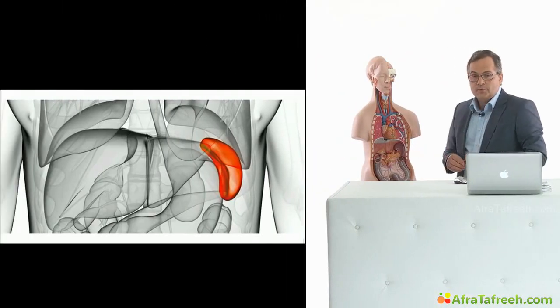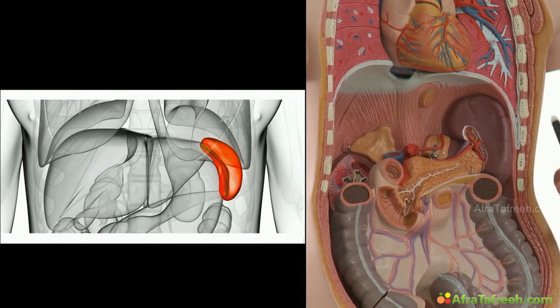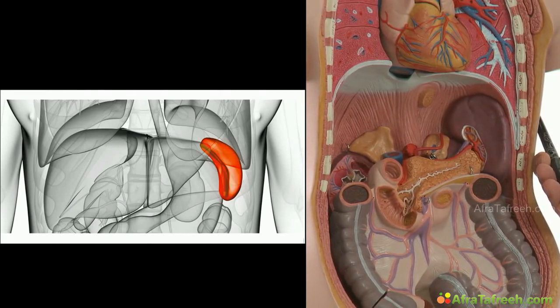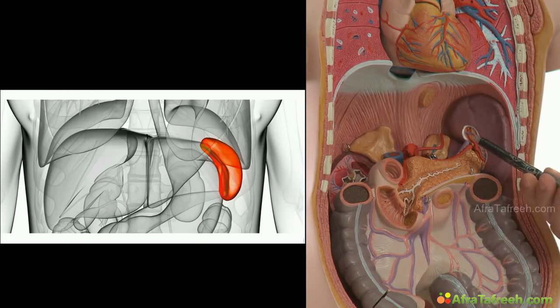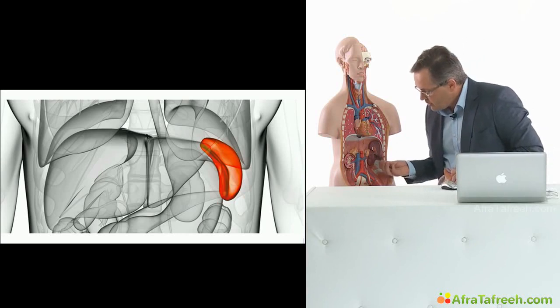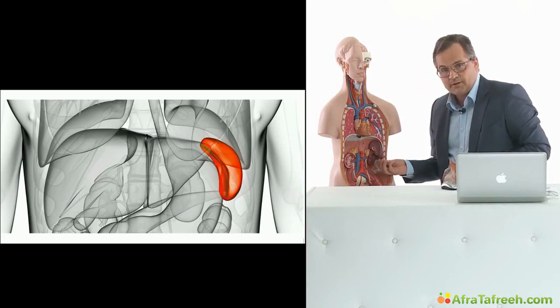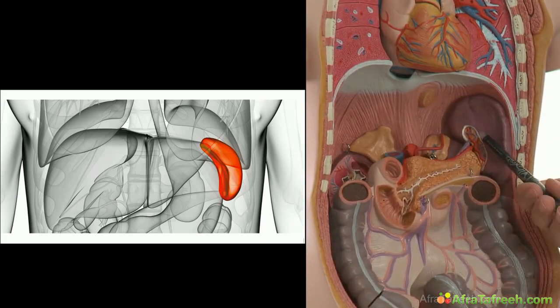The spleen is situated in the left upper quadrant of the abdomen, well protected by the rib cage. The spleen lays parallel to the tenth rib on the left side, is beneath the diaphragm, and its medial face faces towards the stomach. Posterior to the spleen, we find the cranial pole of the left kidney. In the hilum of the spleen, we find the tail of the pancreas.